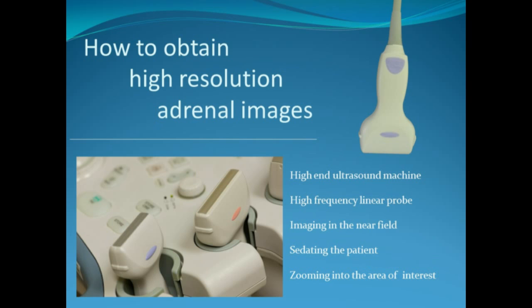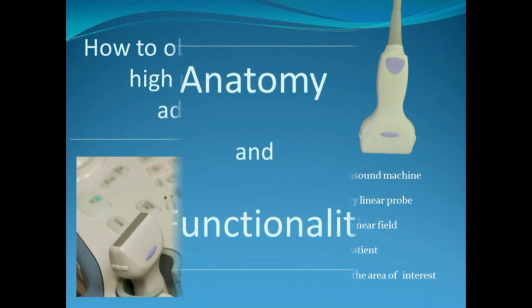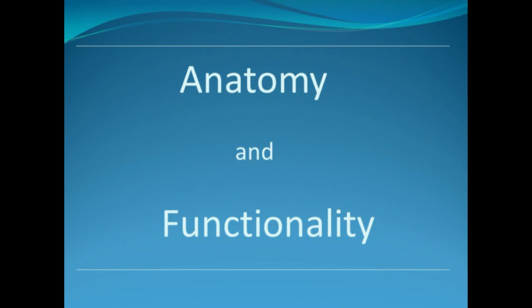You use high-frequency linear probes. You image everything in the near field of the patient. Sedation is almost essential. And then once you have the image, zoom into it or zoom into the point of interest. So let's start thinking of anatomy and functionality of an organ or a gland.